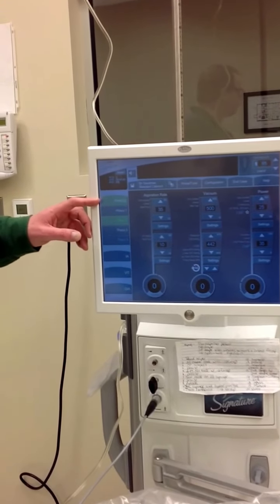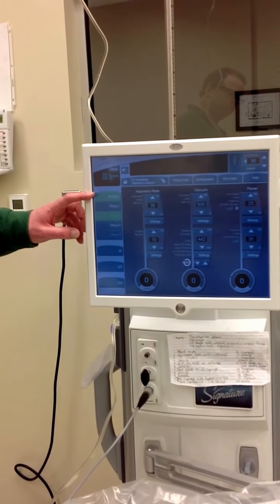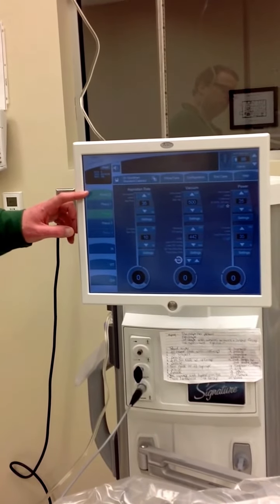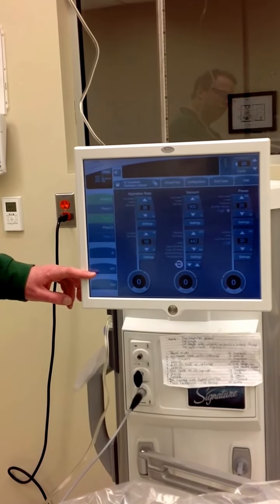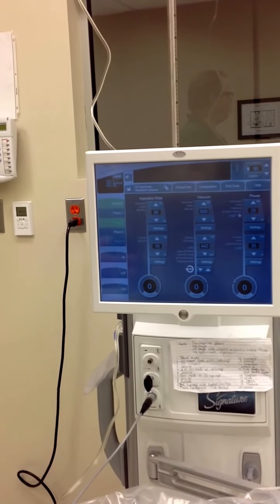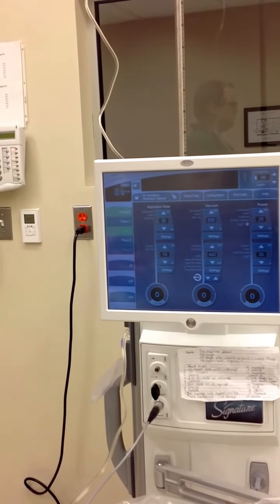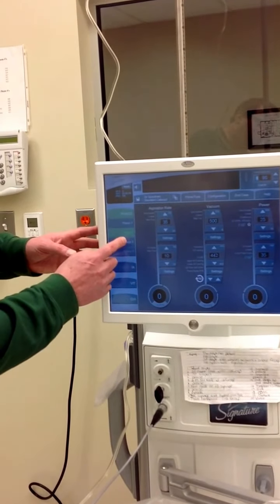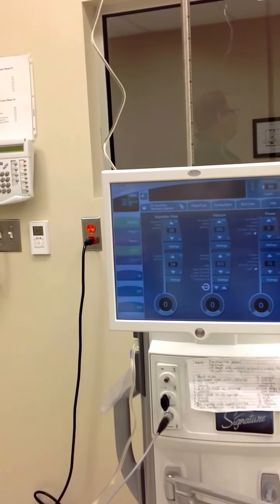And the nurse hits that? Yes. All the modes for the machine to move forward in its program go up and down this side of the screen. Phaco 2 is for evacuating the 4 segments that you've made and then cracked. Phaco 3 is for epinucleus.